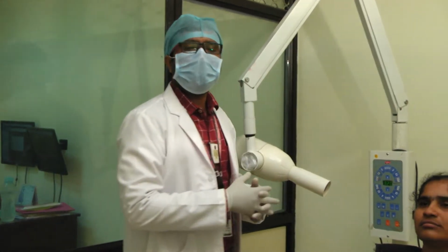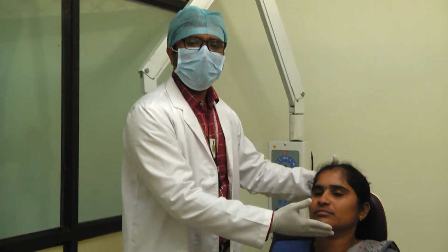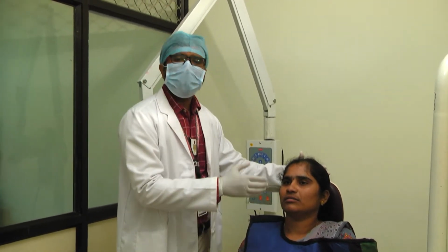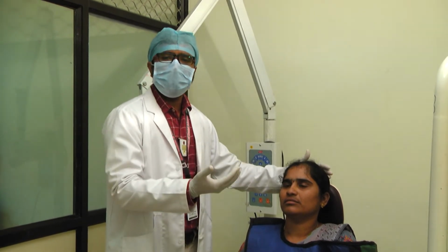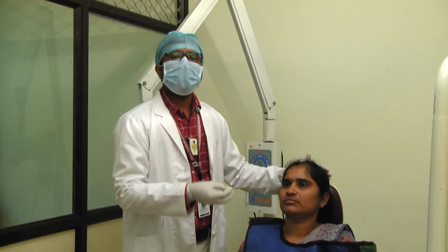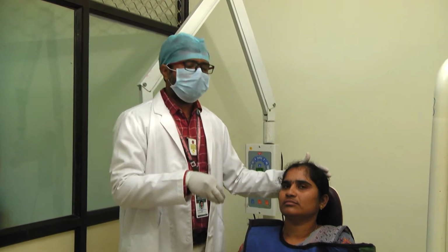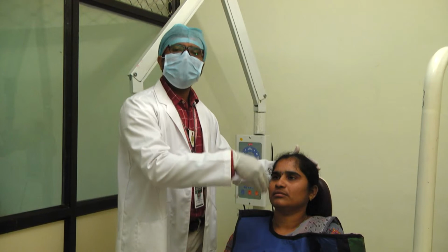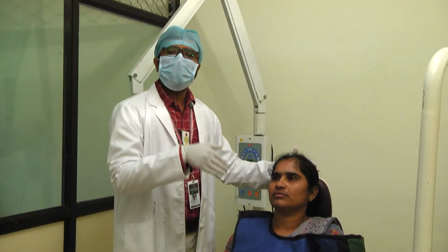The fourth fundamental rule is to examine the oral cavity. Always ask the patient to open and examine the oral cavity for axial inclination in order to modify the film placement, and also for any obstacles like maxillary or mandibular tori. That has to be taken care of while placing the film, as it will modify the placement of the film.